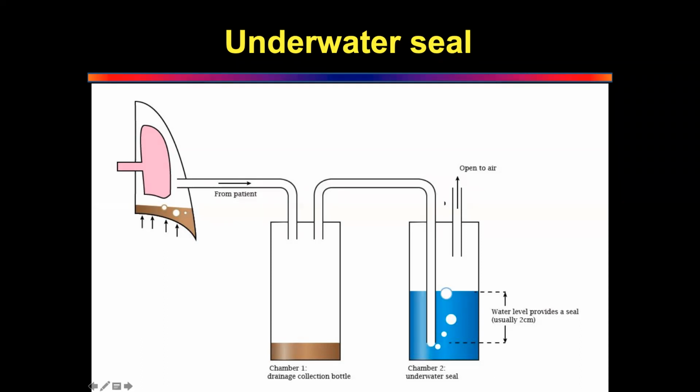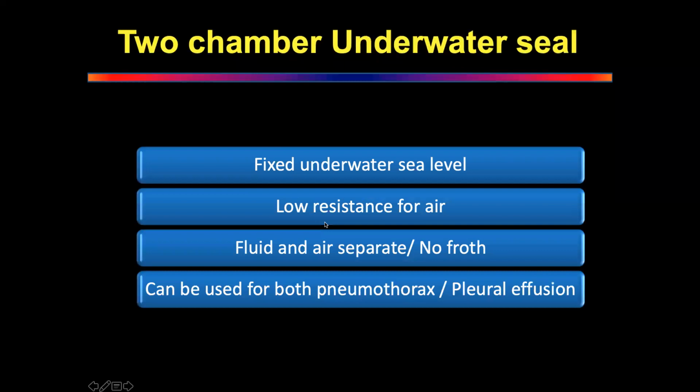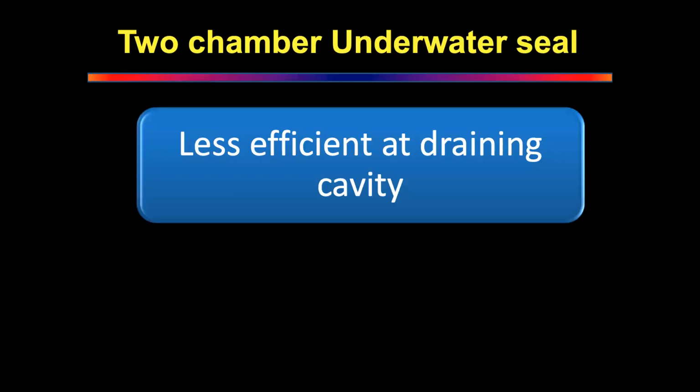Did you understand that? This is very important to understand. The moment you attach suction here, negative pressure bypasses everything. So this is like one tube. Negative pressure is more at the top. The negative pressure is all in here, and the efficacy of the suction goes down with 2 bottles. So what is the next level that you do? 3 bottles. Thank you very much.